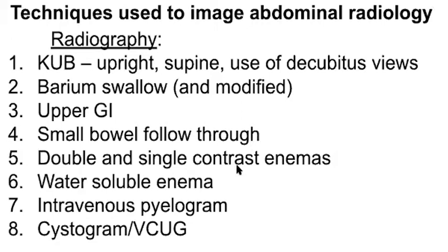And we will use water-soluble contrast when we are concerned about perforations in the setting of obstruction, for example, or bowel leaks that we might see after surgery, and in some cases, fistula evaluation when we think the contrast will go in extraluminal spaces. In these settings, water-soluble contrast is useful because if it does go into the peritoneum from a bowel perforation, the peritoneum will reabsorb the contrast and excrete it renally.